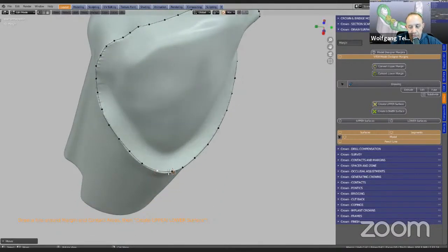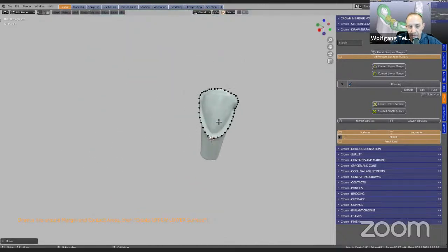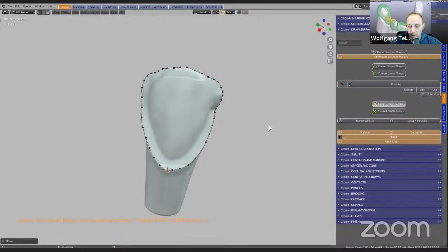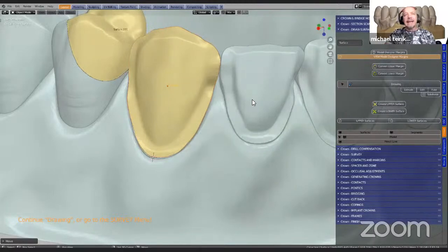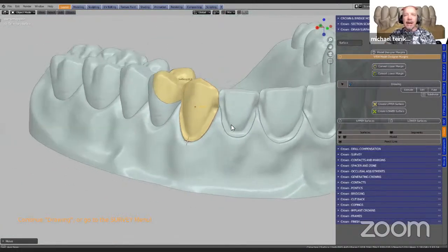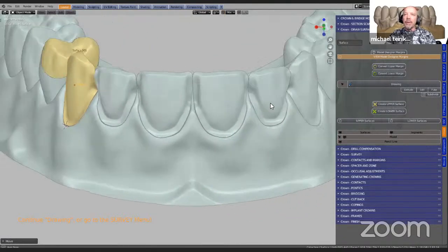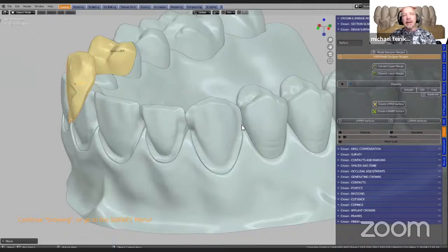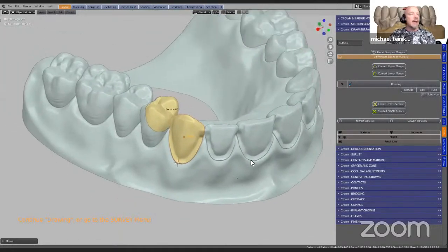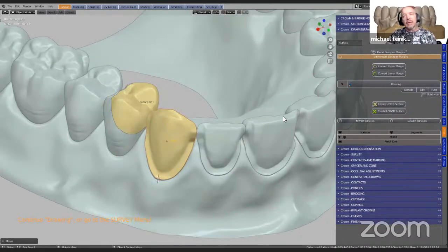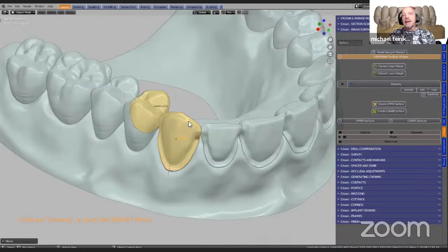So here Michael is just tracing the margin outline, and again by push of a button he will make a new surface. Now these surfaces are color coded: in the upper jaw they are yellow, and in the lower jaw we have them in green. So we're going to do this all the way through to the other side, including the other contact. Yellow is for the top model and green is for the bottom model so that we don't get confused. Once this is all done — these are called surfaces — then we're going to go and survey these.